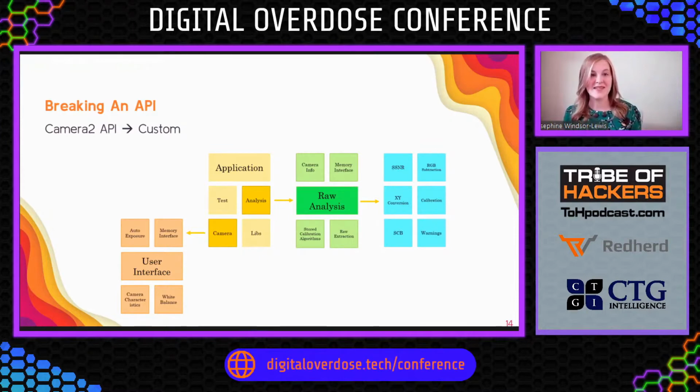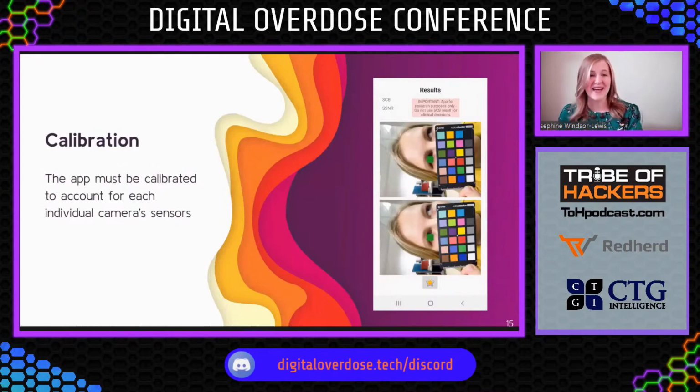And then we compare that using a brilliant algorithm designed by the DJAN team to various different color specs for how yellow is the eye. Is there a level of bilirubin there? Does this child have jaundice?